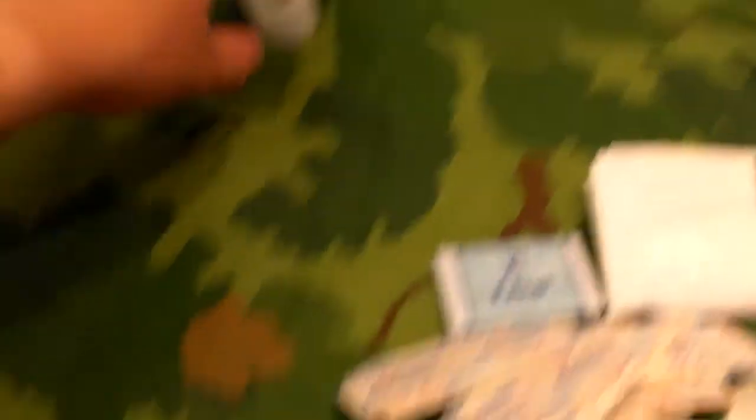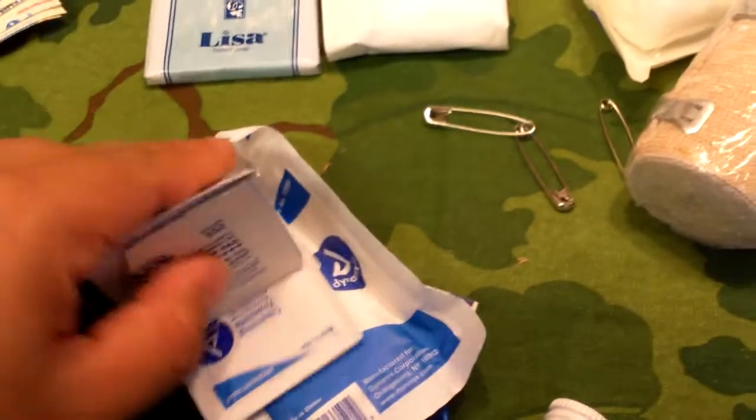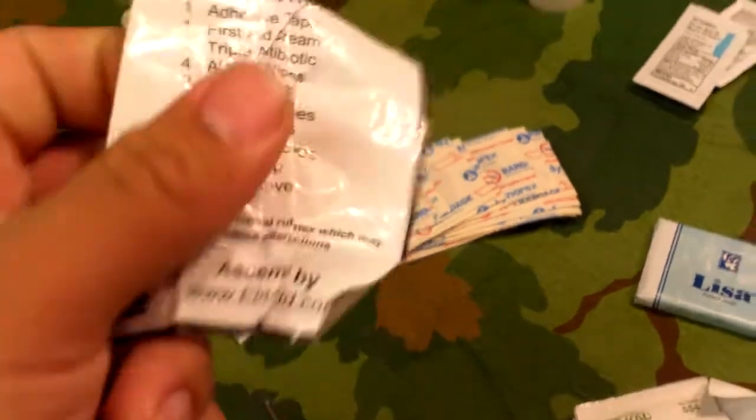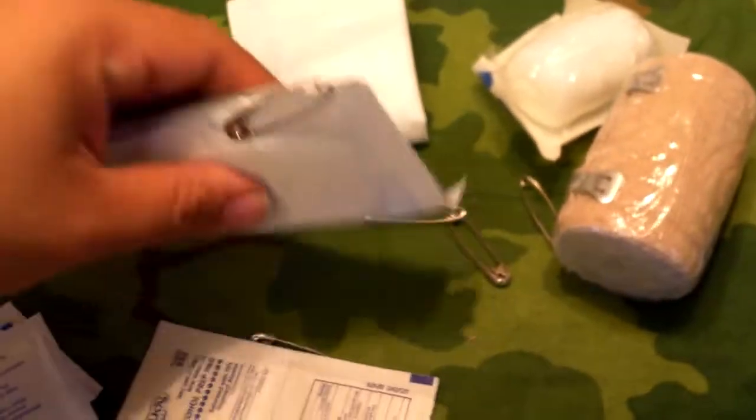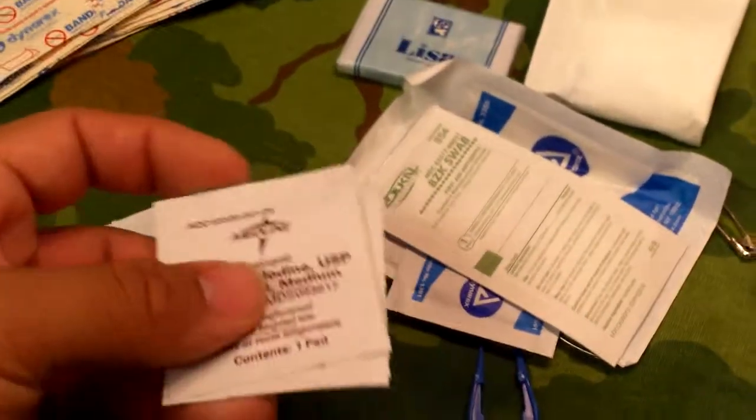It comes with adhesive tape — that's this right here. It's got first aid cream; looks like it comes with one, and here's the first aid and burn cream — triple antibiotic. Then alcohol wipes, four of them, in this stack here. And iodine wipes — probably these ones — you've got two of them.